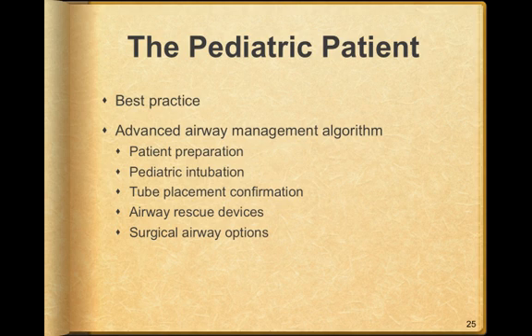As far as the pediatric intubation goes, the adult airway is the size of a dime. A pediatric airway is one-third that size. You're hitting a smaller target. Technique is essential.